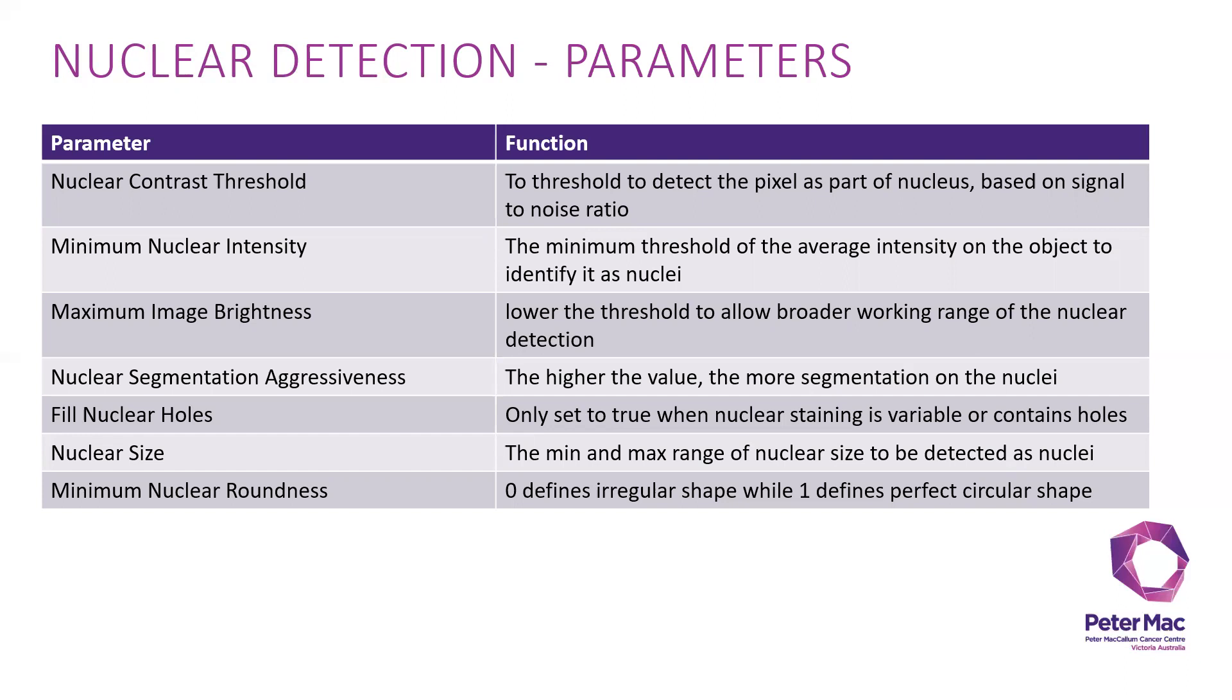You can adjust the nuclear size, the min and maximum range to be detected as nuclei, and the nuclear roundness as well. Zero is the irregular shape and one is the perfect circular shape, which you can use to adjust and filter the nuclei that you would like to detect.